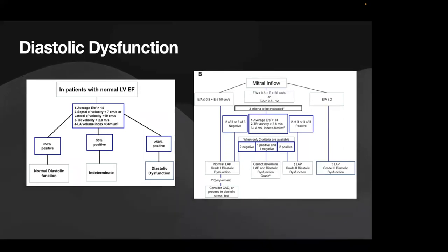I think encouraging people to optimize the pulmonary vein flow is helpful because, again, it's another tool that we have to assess, do I think this is normal or not? If you can conceptualize a chart above this chart that's talking about, well, if your S and your Ds are normal, then you're pretty much going to be okay.